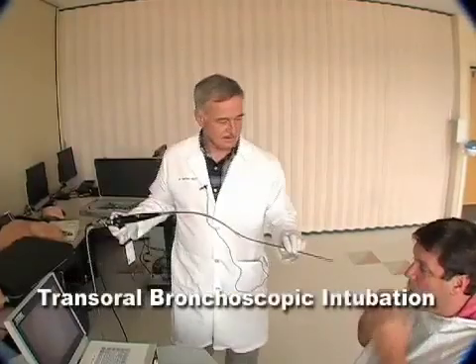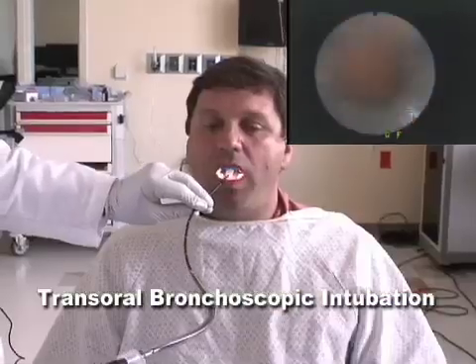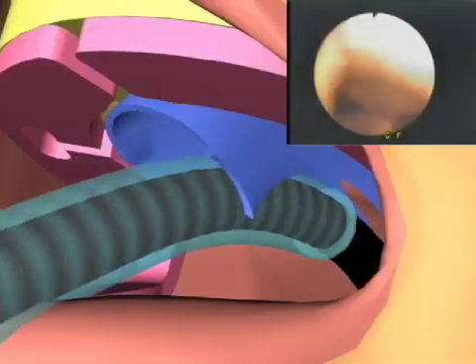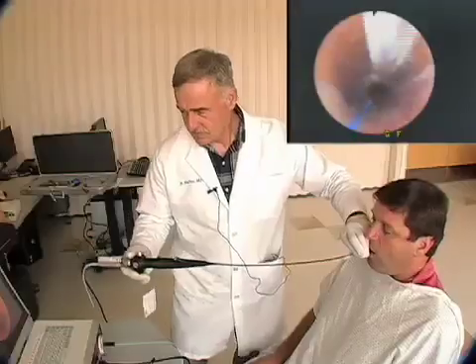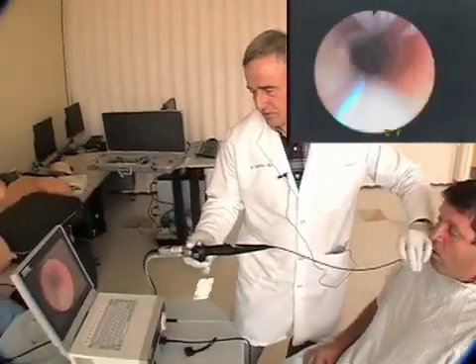I can intubate you now. Now we're going to do transoral bronchoscopic intubation. Here we go. And as you can see, watch the scope as we come out, just to show you that we are intubated now.